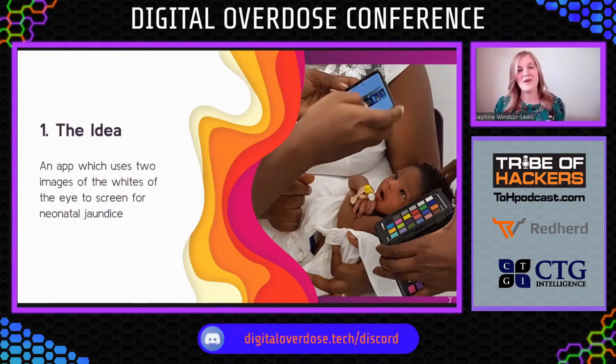Firstly, the smartphone cameras that we have now in modern smartphones. The sensitivity has just increased massively over recent years. And also the technology in the phone. We need a high level of processing power to be running this kind of analysis. And that has only recently become possible.